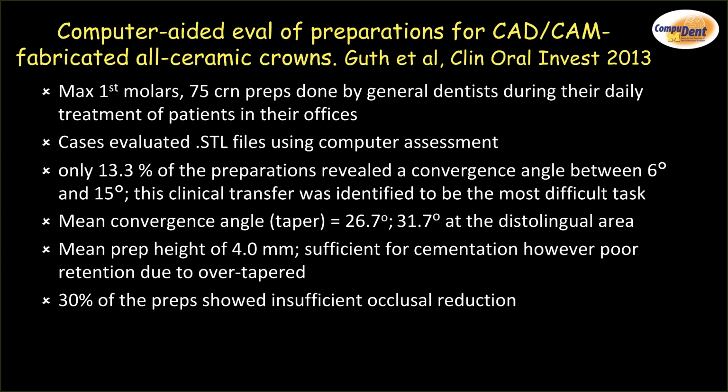And that's an important aspect. Okay, here's a good example of an investigation. They looked at maxillary first molars. These are 75 crown preparations done by different general dentists just during their daily treatment of patients. So there was no specific thing designed to cut this type of prep. It was: do crown preps the way you do in your clinic. Then, these were all digitally recorded files, so they were able to take the STL files and use a computer to assess the different features of the preparation.